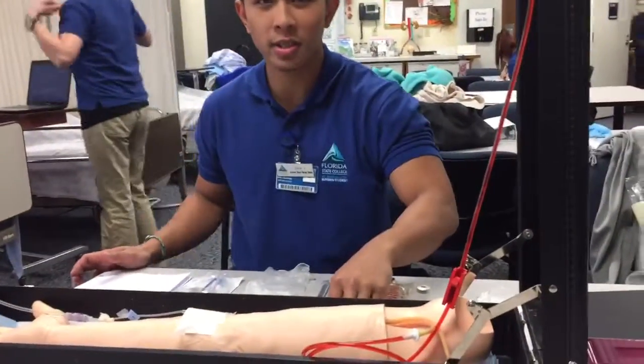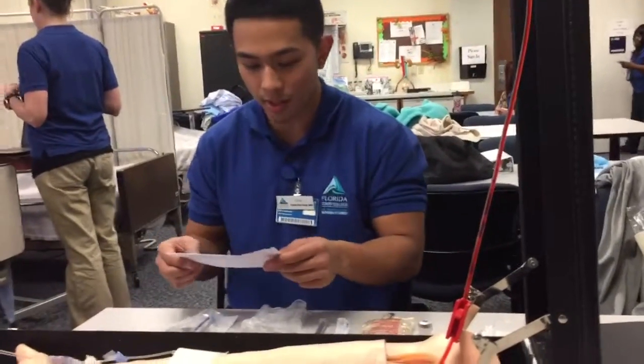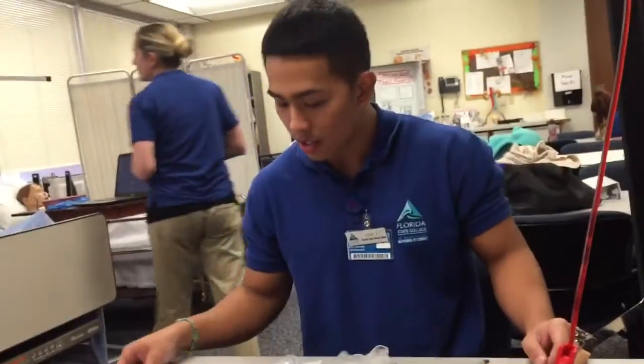Alright, so today we're going to be administering medication via piggyback. This means that the primary line will already be running in the patient's room. More than likely it's going to be normal saline. So I'm going to go ahead and grab my doctor's orders and the MAR again.